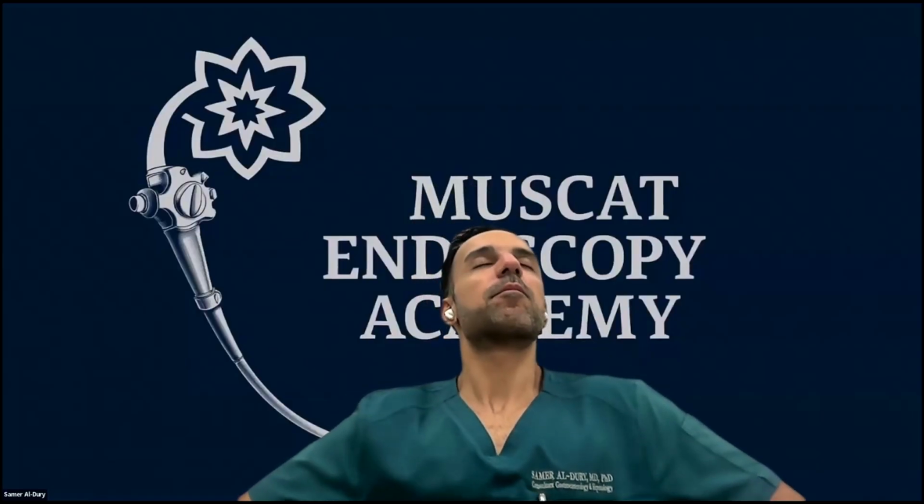The recommendation is if it's a tubular adenoma with dysplasia bigger than 10 millimeters, cold snare polypectomy is not suited. But we're going to touch on that as well. Very good. Yeah, this is such a big topic.